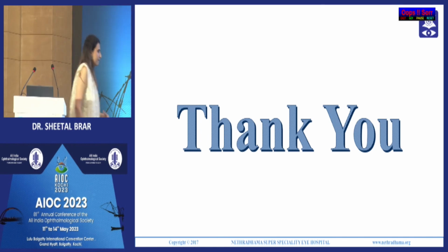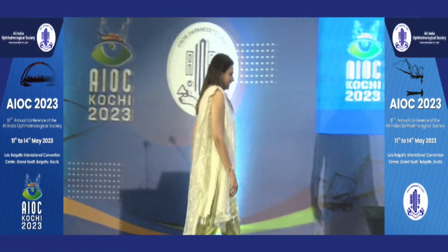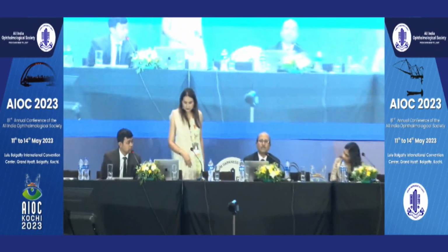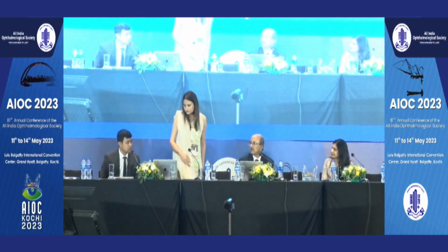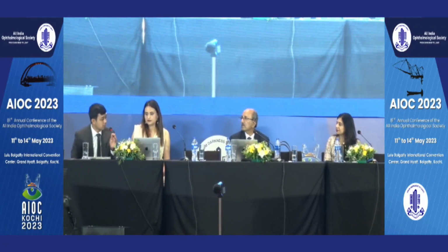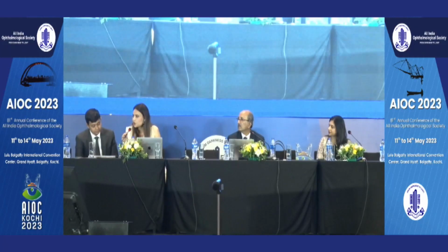Thank you, Dr. Sheetal, for a very comprehensive talk. You ran through so many different formulae and calculators. Today, if you were to operate on a patient post LASIK, post SMILE, is there any specific formula or calculator that you would advise? Barrett True K TK.